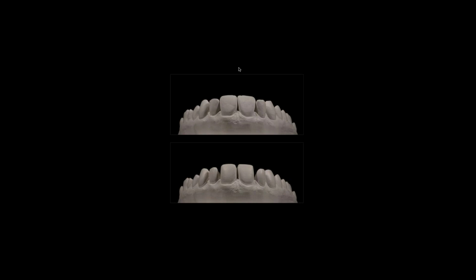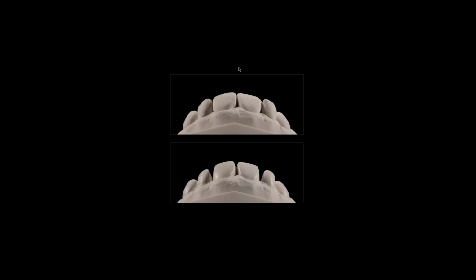And sometimes when I'm sending the wax up to my dentist, if I have time or if the case is very difficult, then I grind my model. I prep the tooth just to show my dentist how I would do it if I'm going to place the ceramic, where I need more space, where I don't need space, where they need to grind more because of changing colors or something like that.